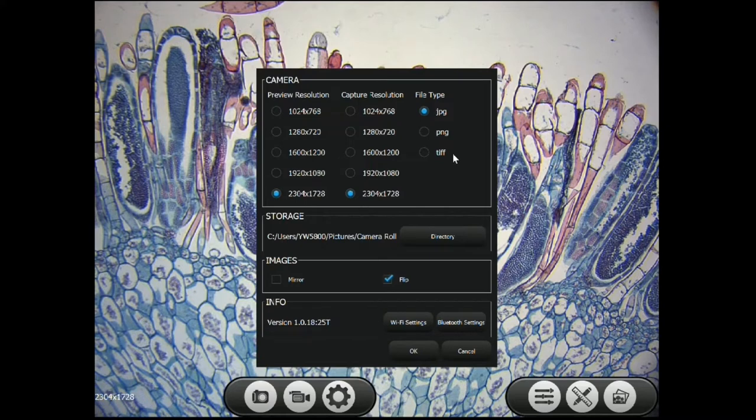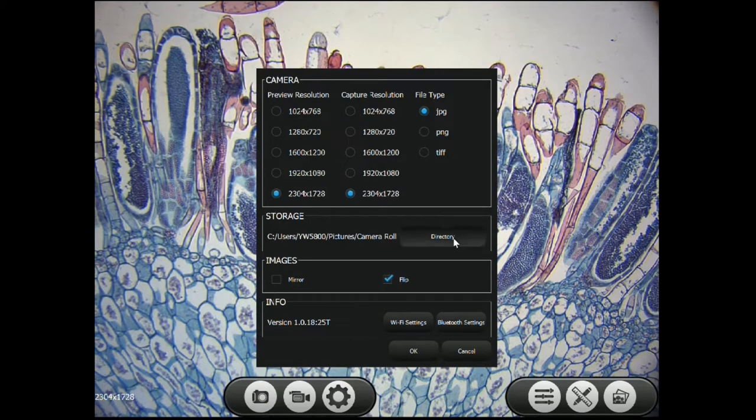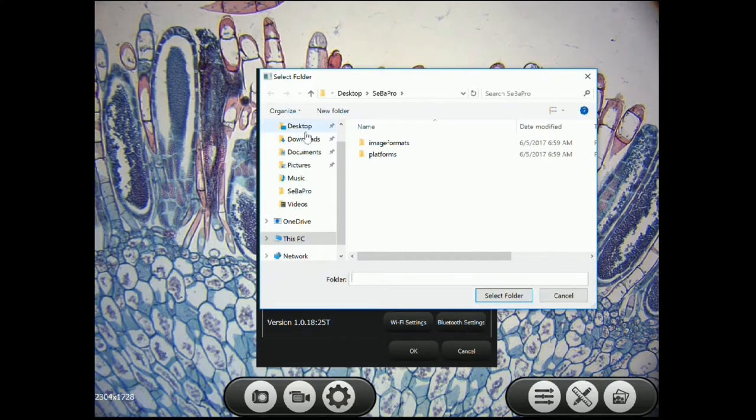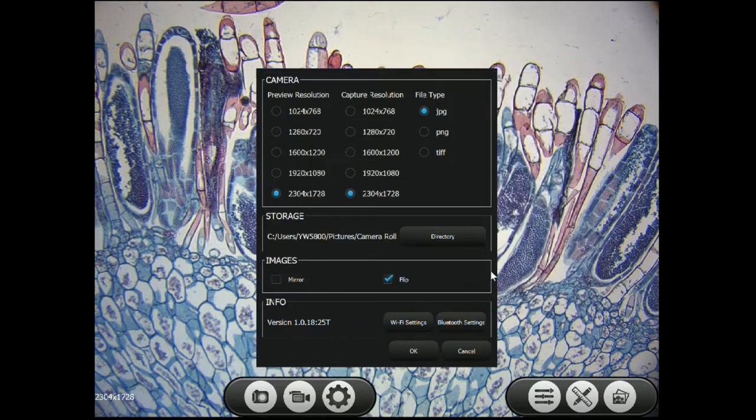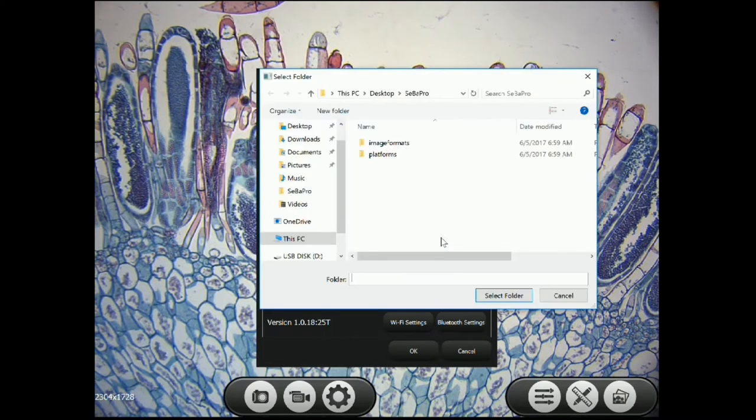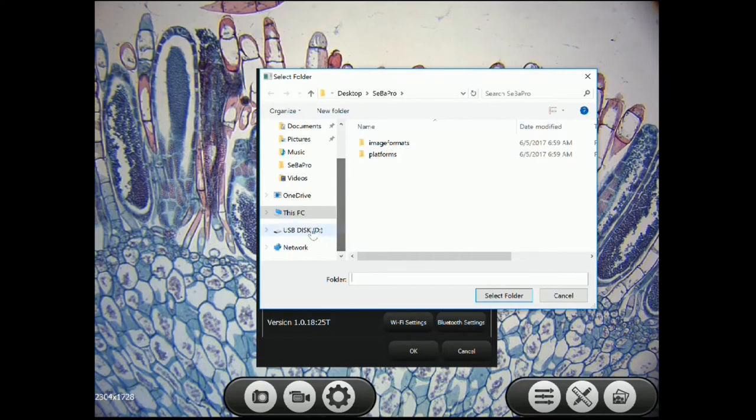The last row of settings are the file types you can save as. To choose where to save your files, you can hit the directory button. We recommend leaving it at its default, but you can store it where you would like. To access a USB, first insert the USB, hit directory, and it should be listed under the D drive.